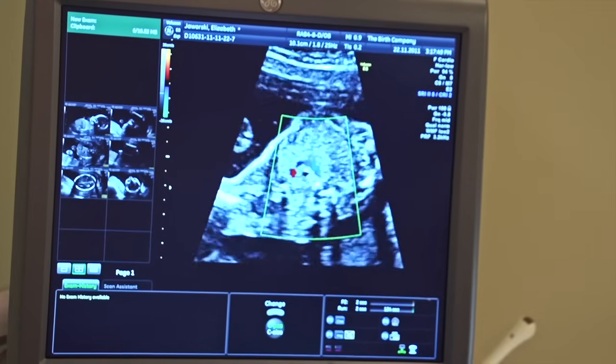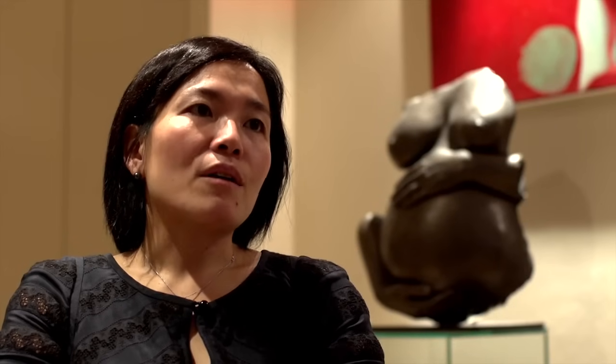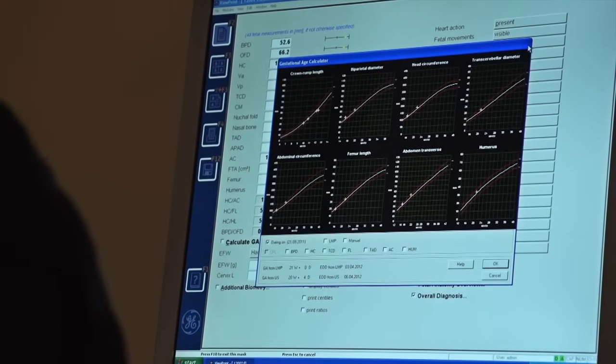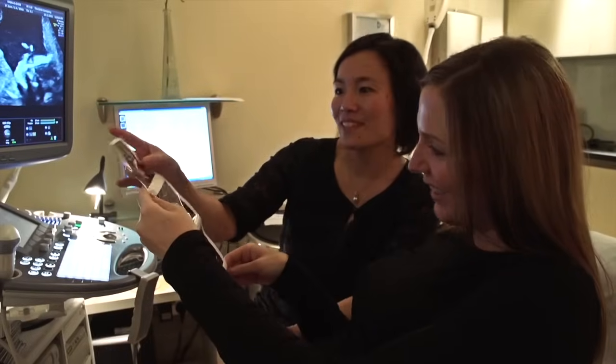At the end of the anomaly scan, we will be able to print out a report, which will include all the baby's measurements on it, and we'll be able to photograph the baby's face and give that out as digital photographs or a DVD.